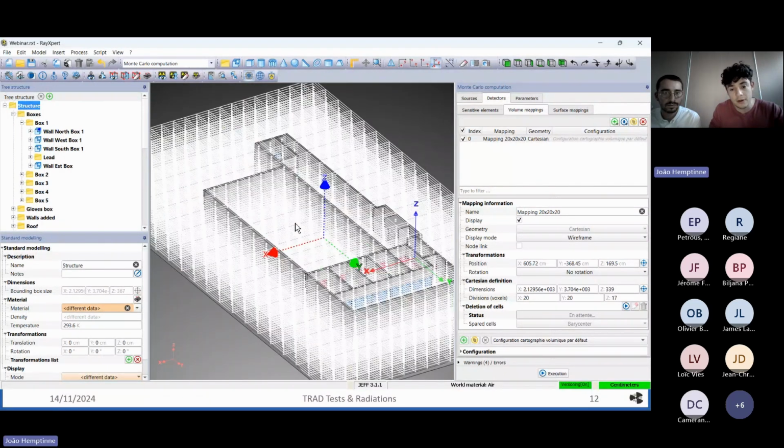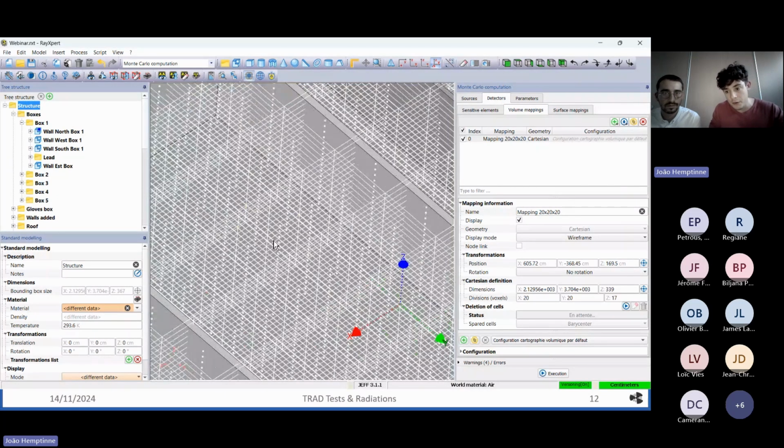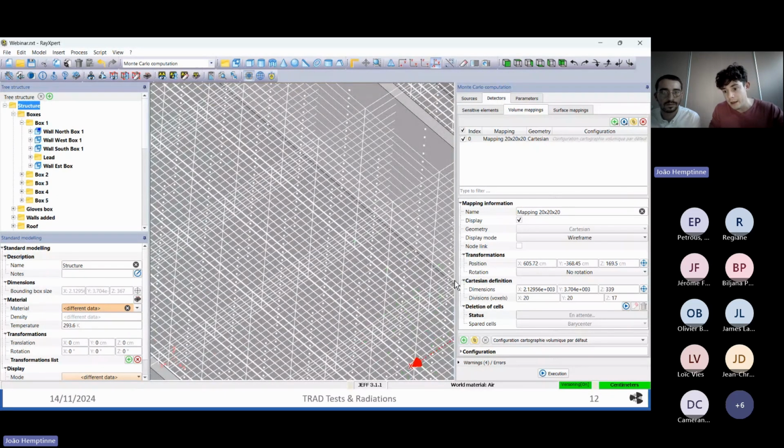Okay, here you can see all the area covered by the 3D mapping. Okay, so the center of the mapping, as I said just before, is right there, and these dimensions are here to set the accuracy of your 3D mapping. Okay, if you want bigger or lower resolution on your 3D mappings. Here, for example, the length of one mesh along the x-axis is 2000 divided by 20.